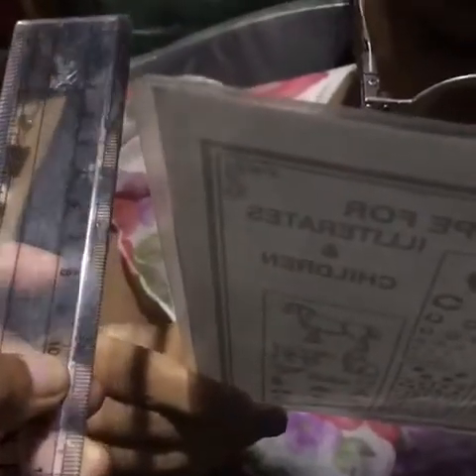Now it's blur. Now it's blur? Yeah. Okay, can you please blink once? Yeah. Is it still blur? Yes. Okay, so she says when it's at 10 centimeter, she is blurred.